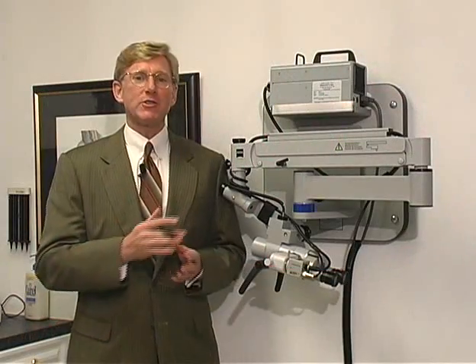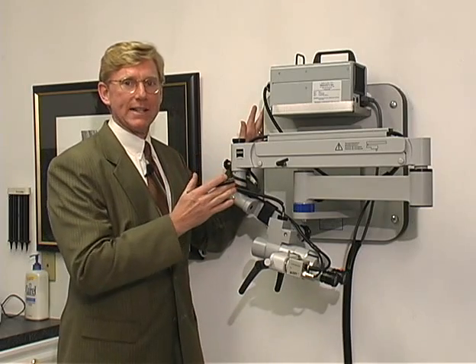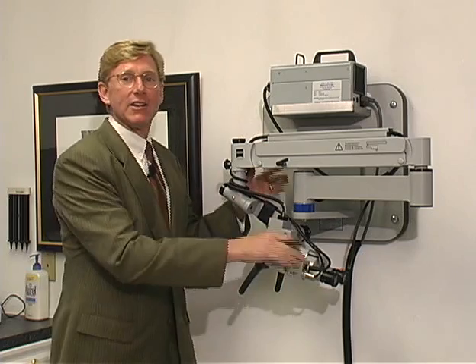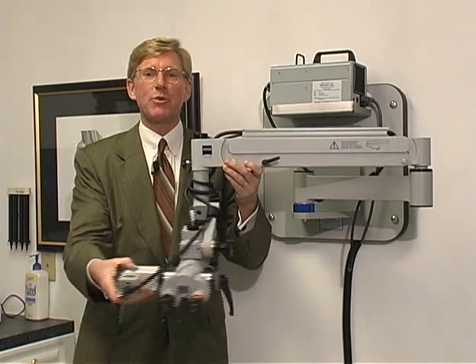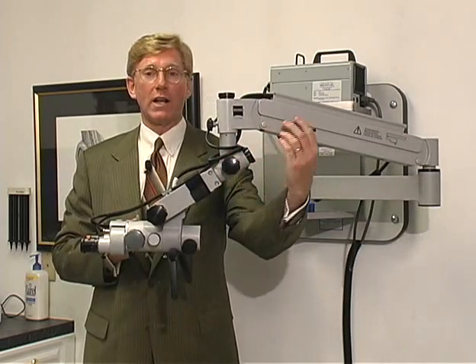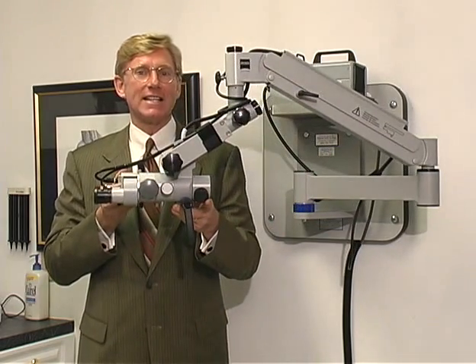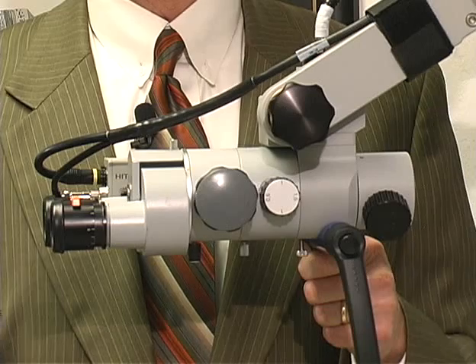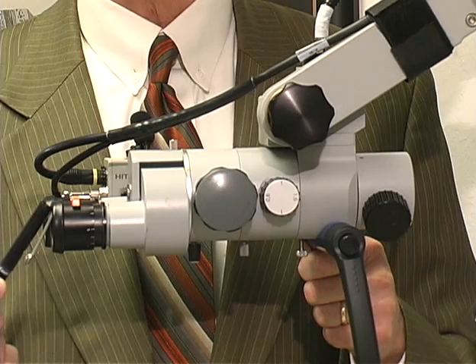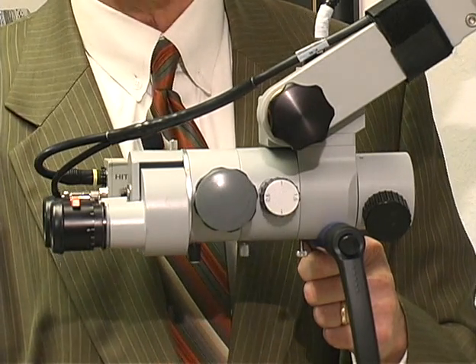The microscope is compact when not in use. It's mounted on the wall with a wall plate that can be installed by your Prescott's technician. The flexible arm easily swings out with tighteners to keep it in position while in use. The most important part is the Zeiss Binocular Lens System, which includes independently adjustable binocular lenses, level of magnification control, and fine focus control.